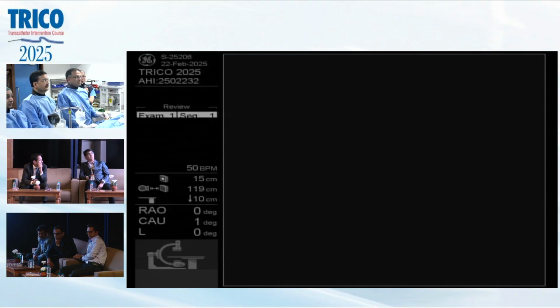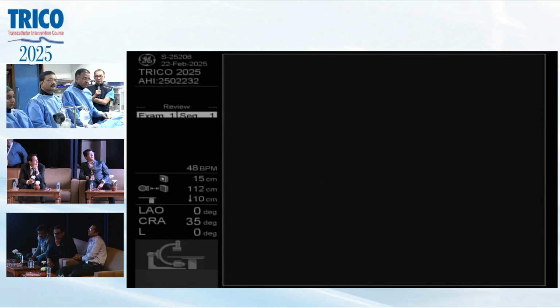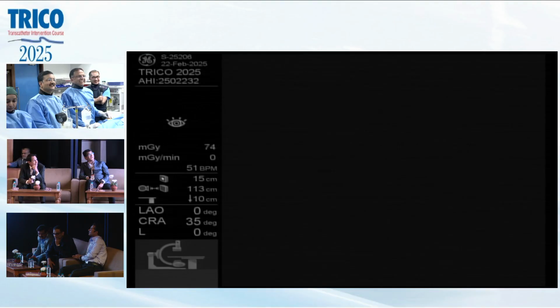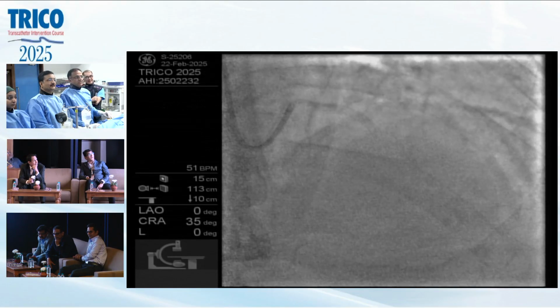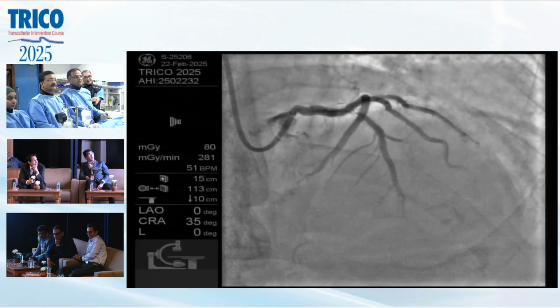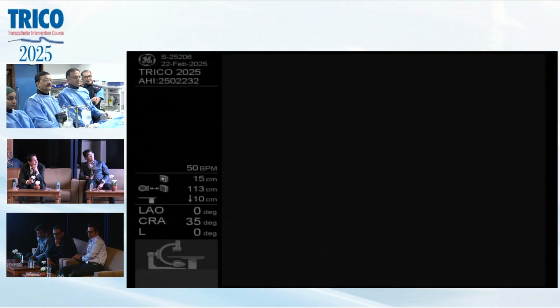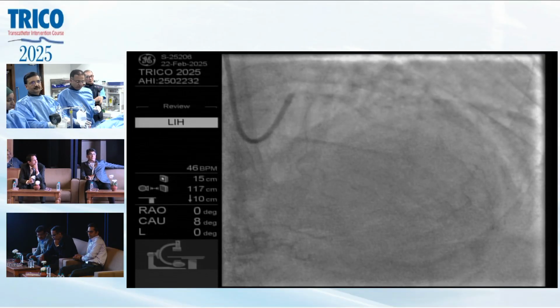Yeah, that is collateral to the RCA CTO. Are you going to do it? No, leave it for you, Doc. Okay, sit in. Very complex. Very complicated case. Let's go caudal again. We'll try to wire in caudal, right? Yes, run through with it.